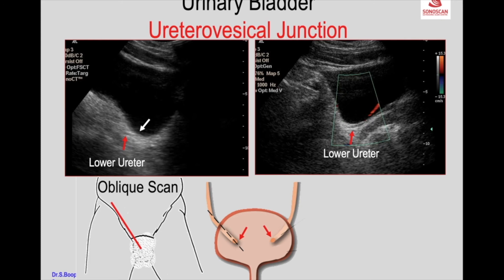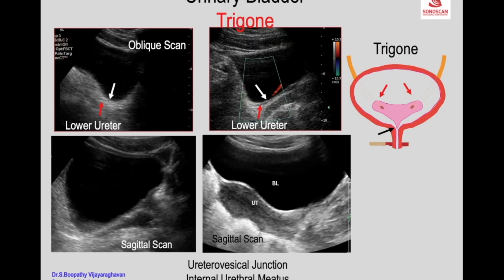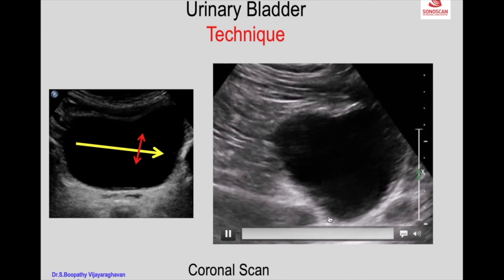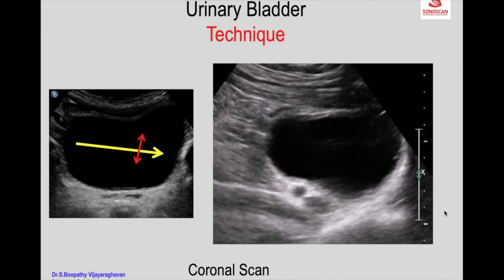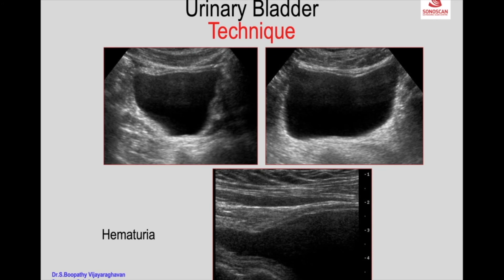Similarly, when you apply color Doppler you can see the distal most ureter with the jet — that is the trigone. To identify the trigone, you identify the internal urethral meatus in the male and in the female, and then the uretero-vesical junction. This will be the left lateral wall of the urinary bladder, which is useful in certain situations, as the following illustration will show.